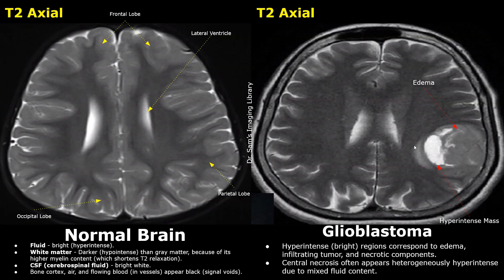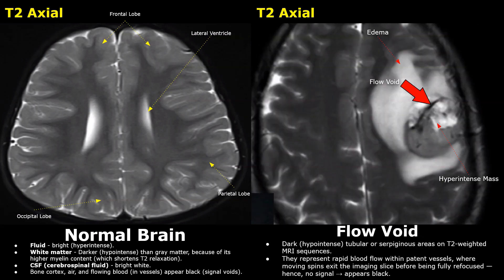Comparison of T2 images with T1, T1 contrast, and FLAIR images is very helpful in the diagnosis of glioblastoma. In some cases, you may see flow voids on T2 images. A flow void appears as hypo-intense tubular or serpiginous areas inside a mass. This is seen when there is rapid blood flow within a vessel, so you may find these flow voids in some glioblastoma cases. Also, there is edema near the tumor.